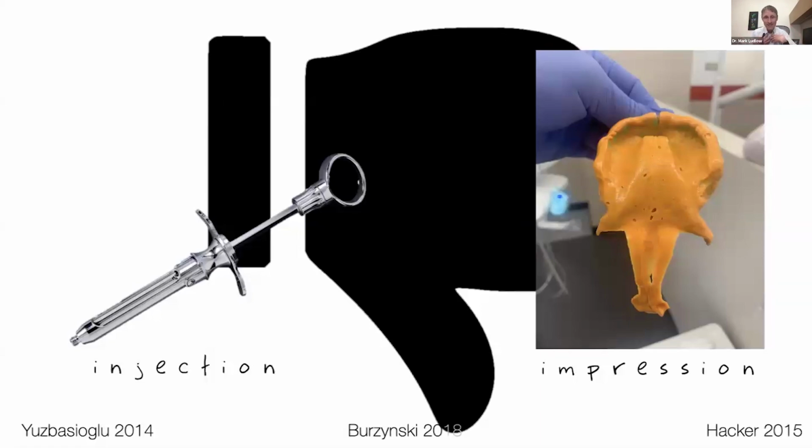Now, for us in the dental field, this is commonplace to us. We hit the rite of passage in dental school. That day when you're filling up your tray, putting it in your buddy's mouth, alginate gone everywhere, and at that point you think, I've arrived, I've become, I'm finally part of the dental community. And so for us, it's commonplace. But for our patients, it's not commonplace.